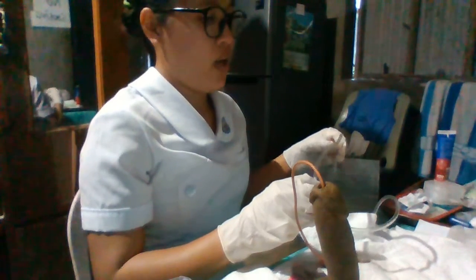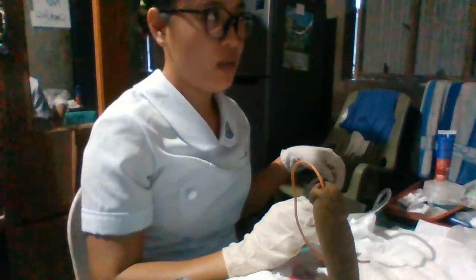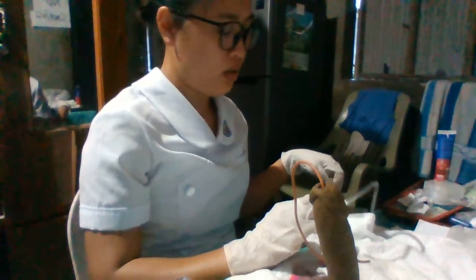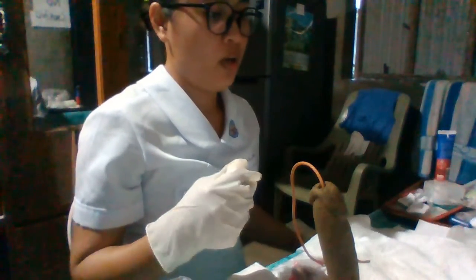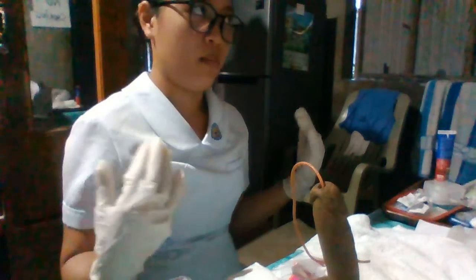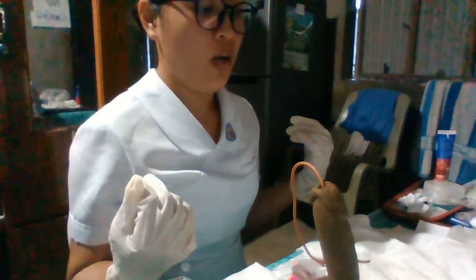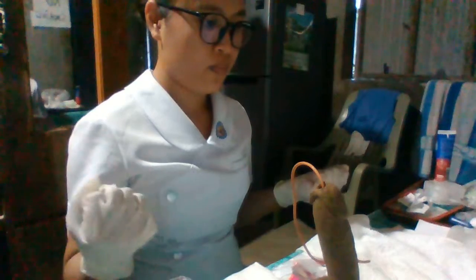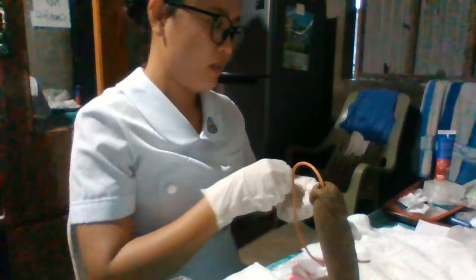And next, we're going to assess the client's safety and if he is in a comfortable position, and we're going to dispose of the gloves and supplies that we used, which may have been contaminated.